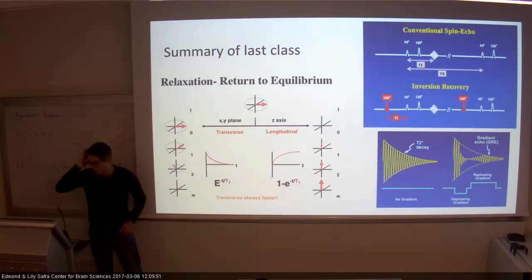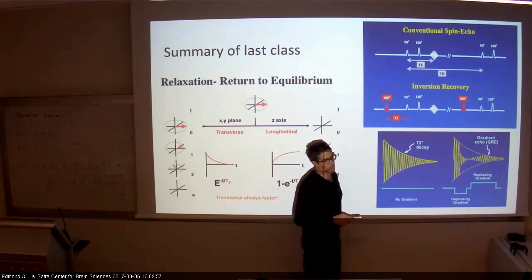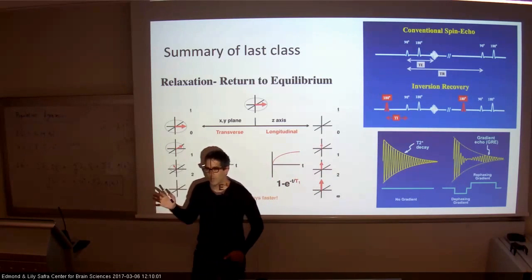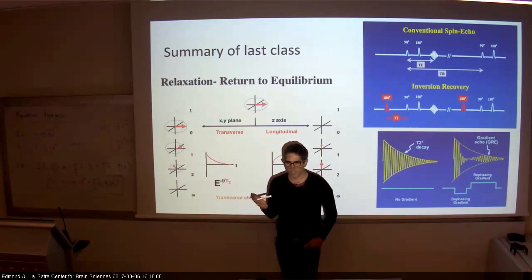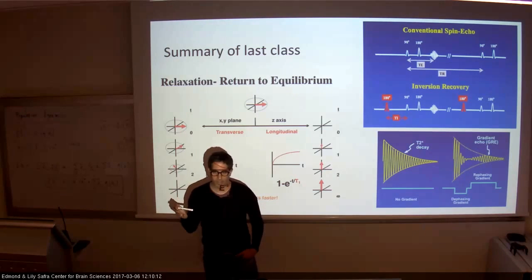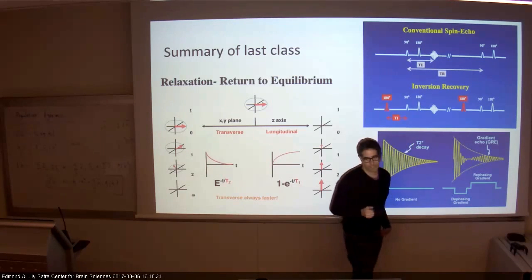And I was also measuring the gradient echo sequence. We were saying that in general, if we were doing nothing, we're just doing 90, we'd get something which we call the free induction decay, right? The signal was falling pretty fast, and was affected by T2 star, which we said is important because that's the thing we also measure in fMRI. Do you remember that? And then we said we can actually create an echo also in here by using gradients.